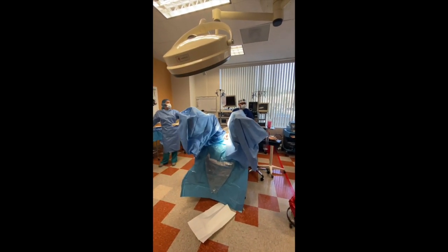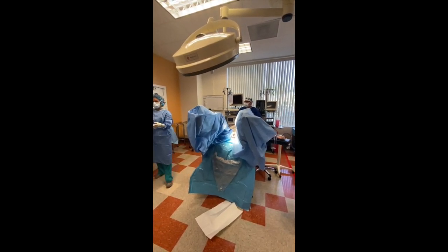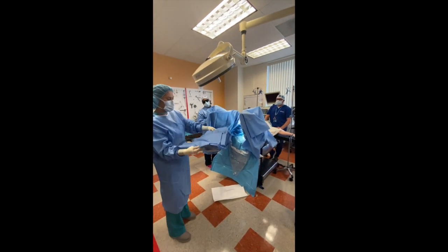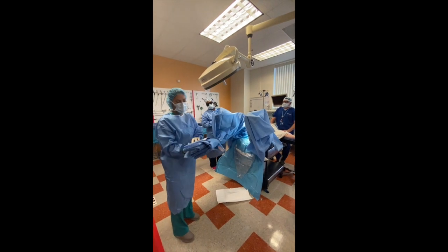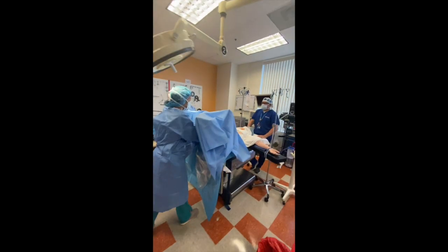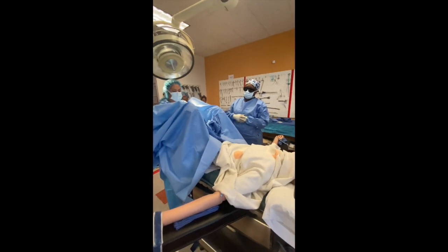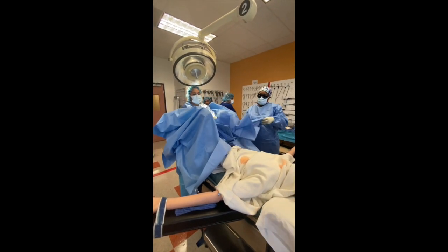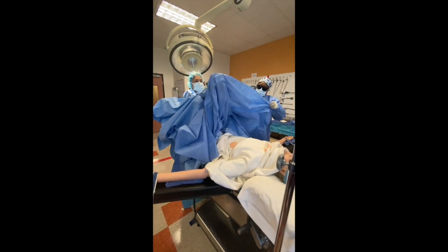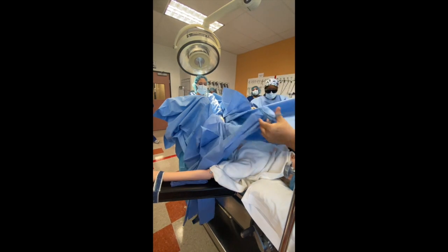Center fenestrated body sheet over the perineal area, extend upward. This is a laparotomy sheet, which works fine — we would take the stickies off in the real world. The man's legs are here, so they match the man's legs here. Press it because the stickies will stick onto the patient. I'm going to find the edge, try to cuff my hands the best I can. Let anesthesia pull that up.